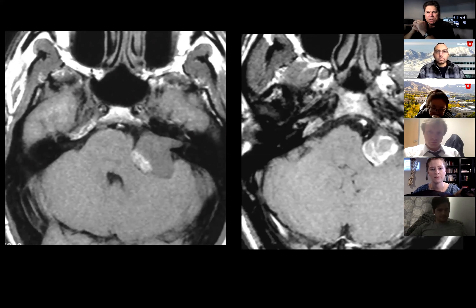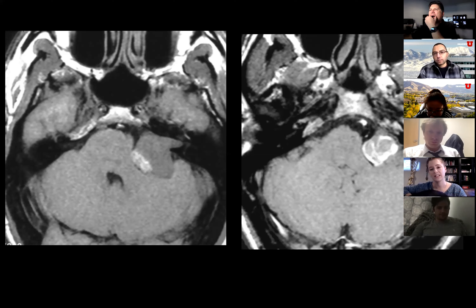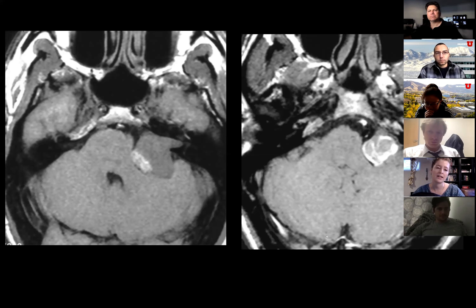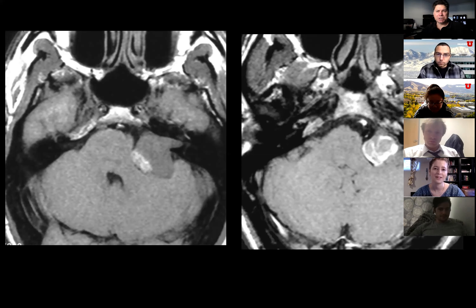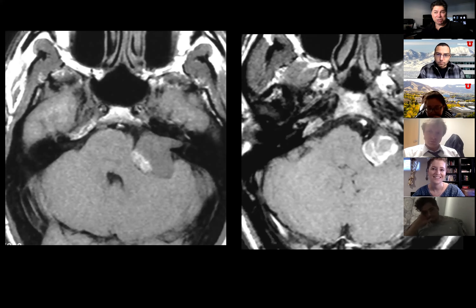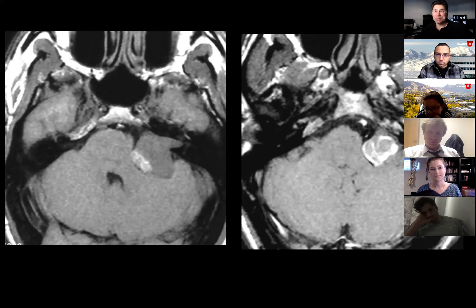What do you think about that signal intensity? Intrinsic T1 signal could be blood. Is that common with a vestibular schwannoma? No — but vestibular schwannomas are very common. This patient has sensorineural hearing loss. If a patient has sensorineural hearing loss and shows up with a lesion of the CP angle, 90% of the time it's a vestibular schwannoma — it doesn't matter what it looks like. It has big cysts, it has blood — statistically, it's most likely a vestibular schwannoma.